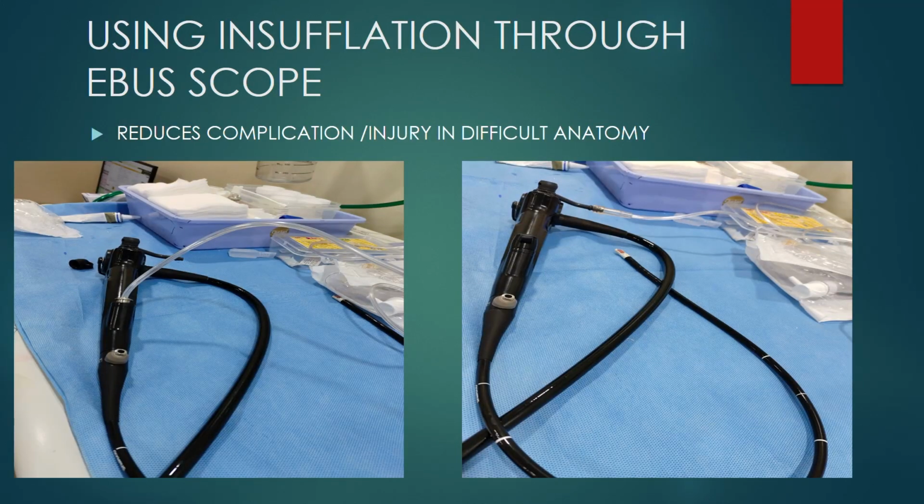And yesterday we were demonstrating this one for the beginners. If somebody has difficulty, I tend to ask them, do you have any difficulty swallowing capsules, tablets, big tablets? If they have difficulty swallowing those things, and in rheumatoid patients and those with a previous history of webs, one needs to be careful when introducing the rigid scopes. And these are the two ways of converting your scope to inflate the esophagus. I think that's the end of my talk.